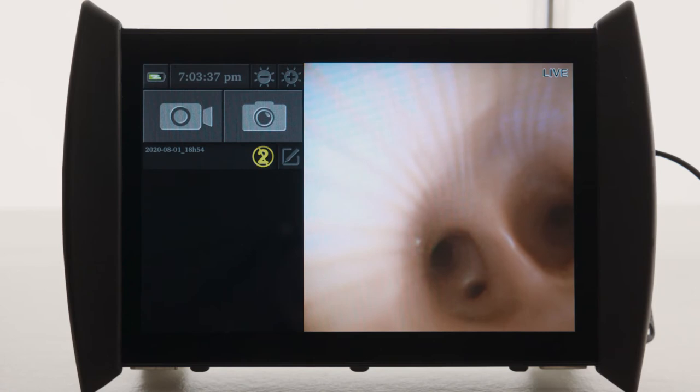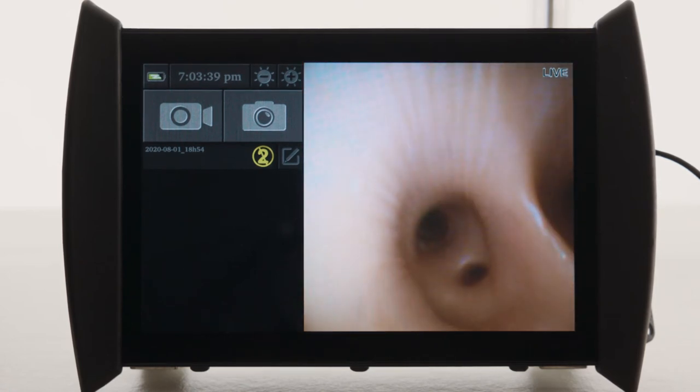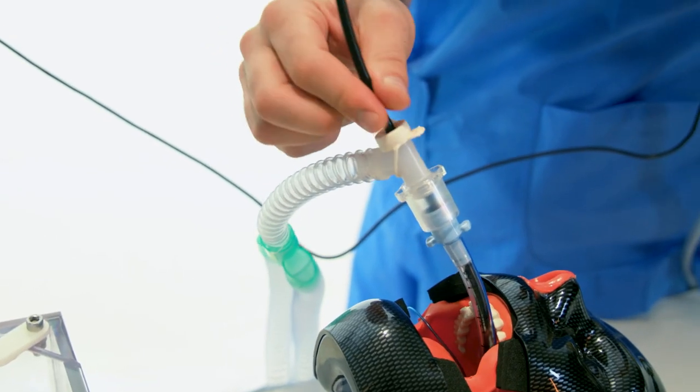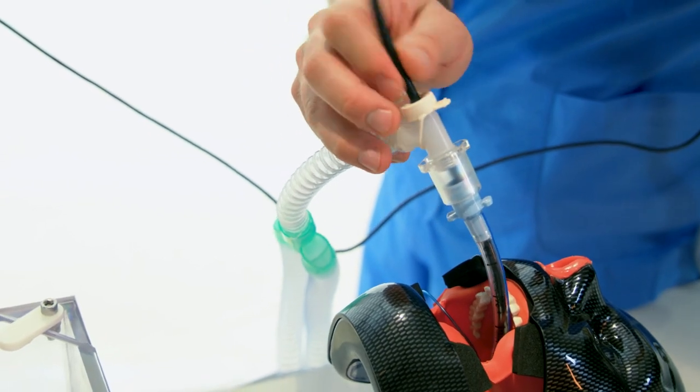During insertion, the insertion tube must remain straight to avoid kinking and ensure that the movements of the wrist are transmitted to the distal tip.